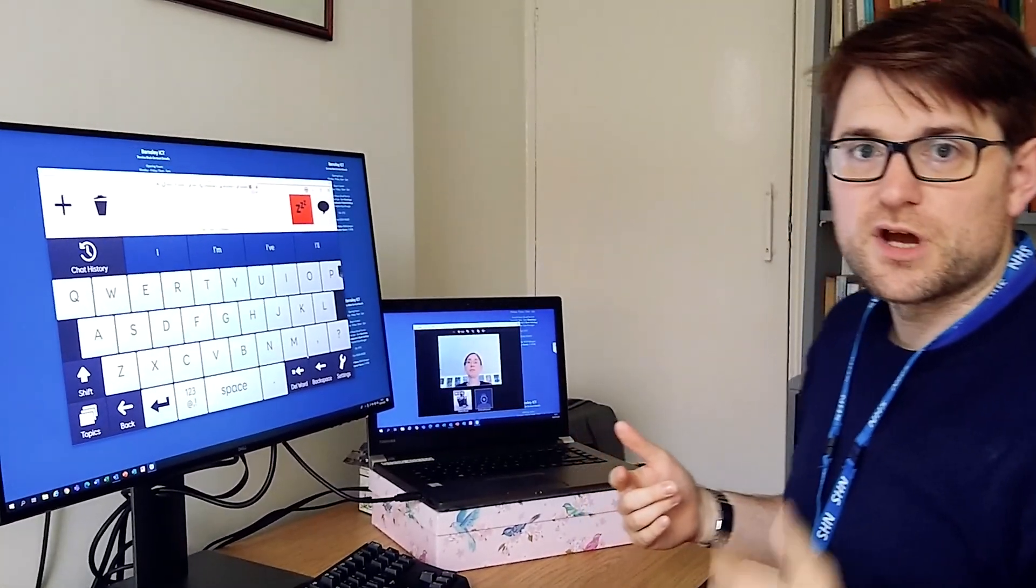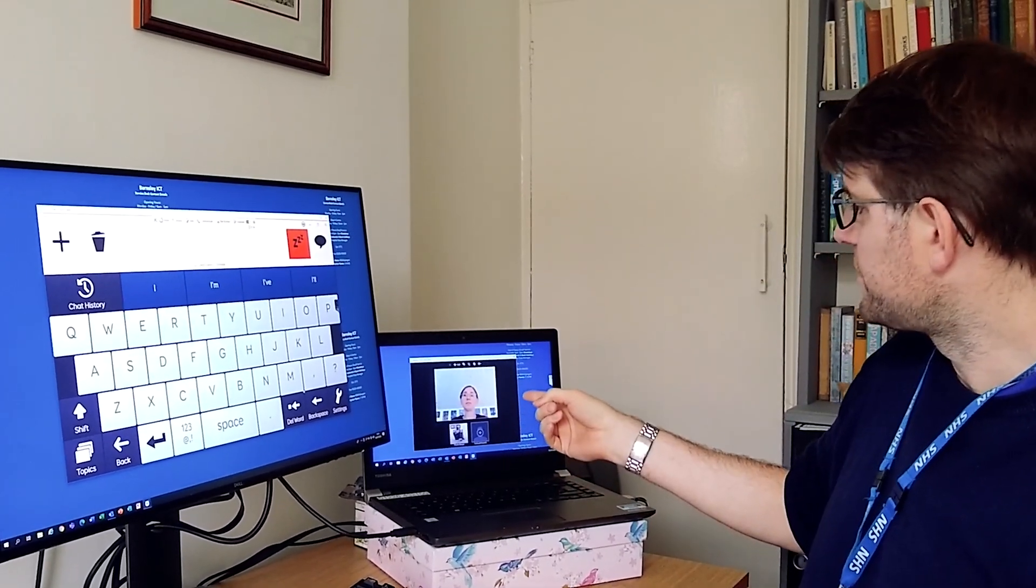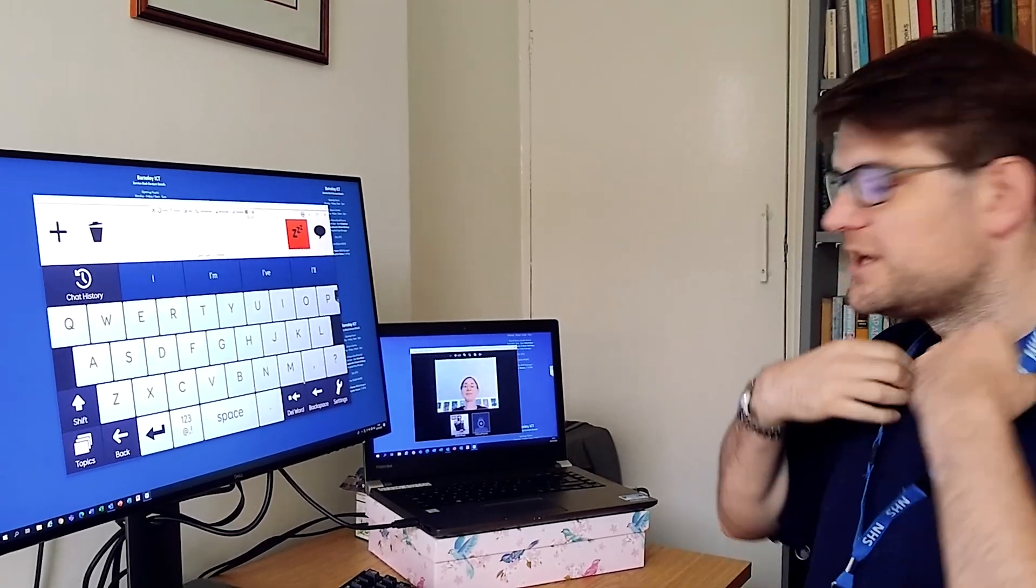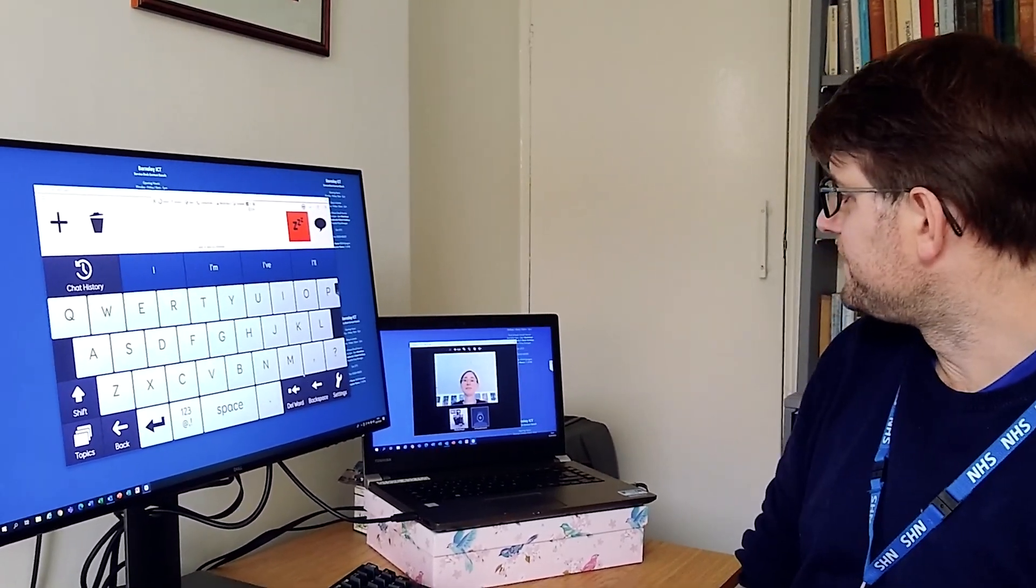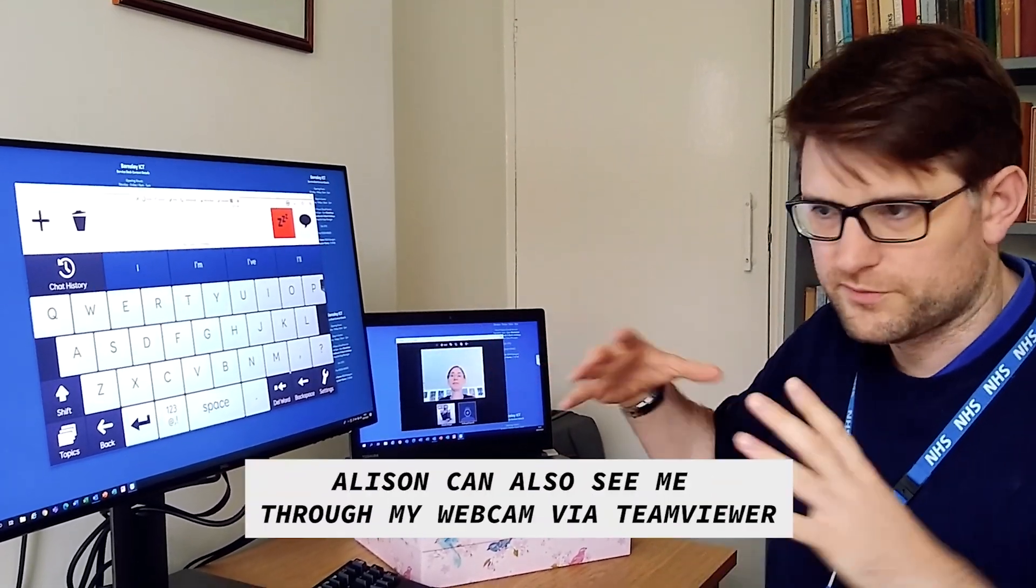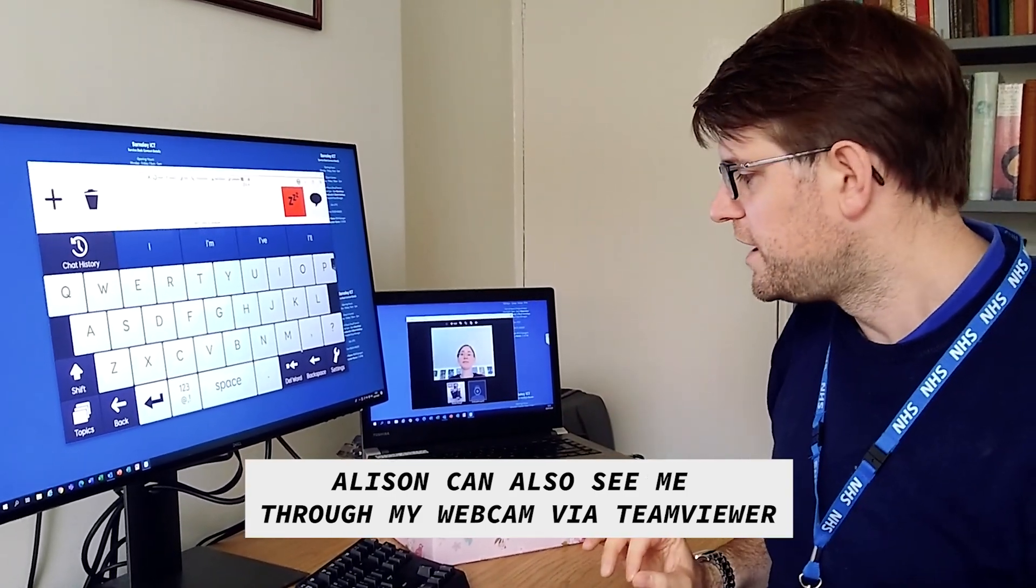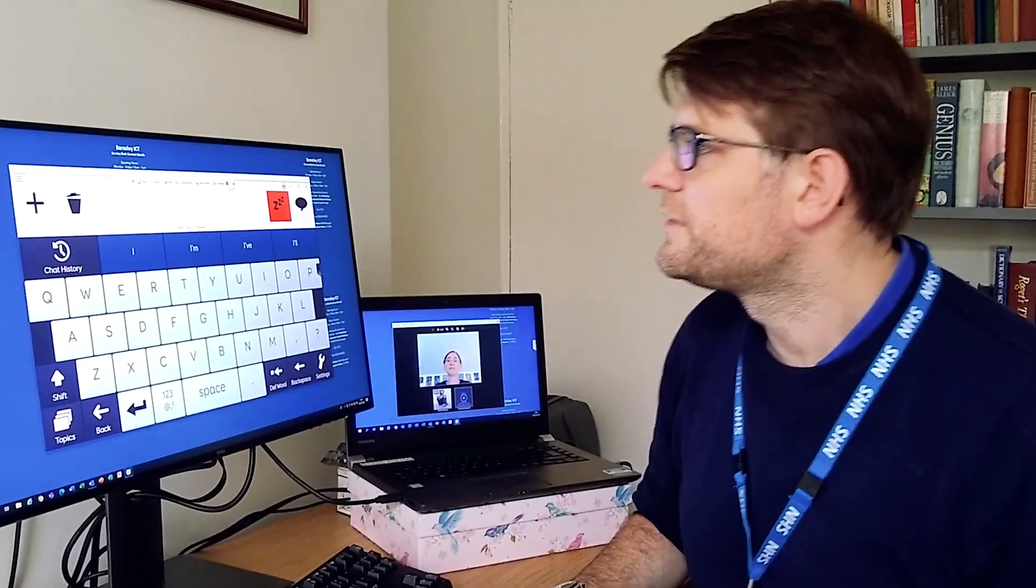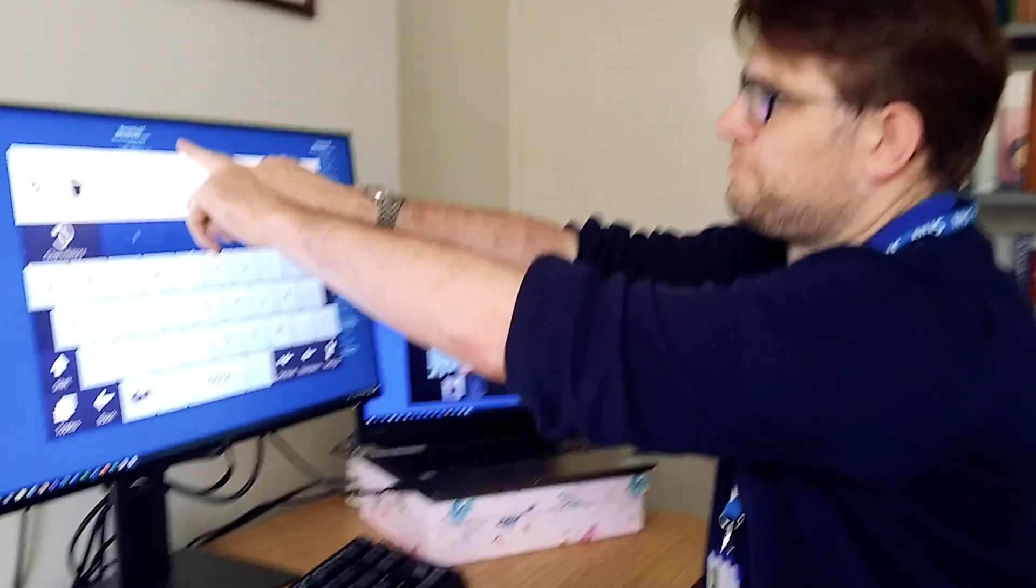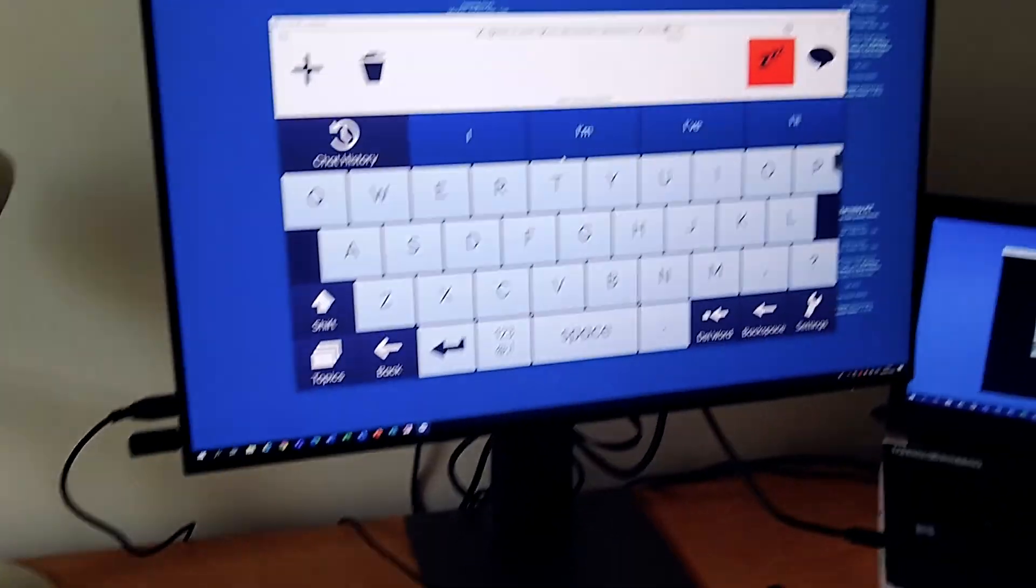TeamViewer allows you to connect via video using the webcam at the top of the eye gaze device. Alison has volunteered to be my patient for today, and this video stream is coming from the webcam at the top of the eye gaze device, not the camera itself. If I want to see Alison using the eye gaze camera, then I can have a look on here.